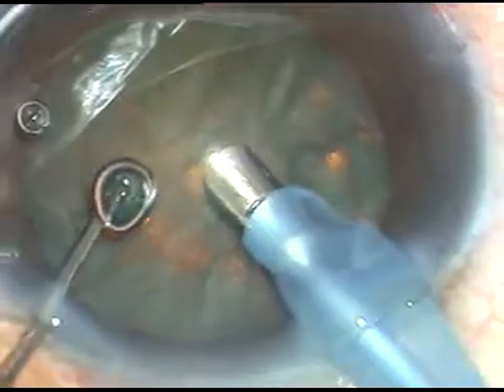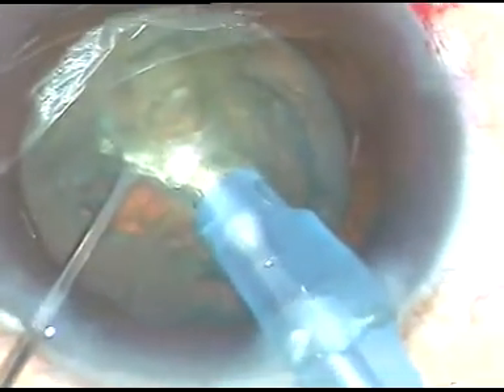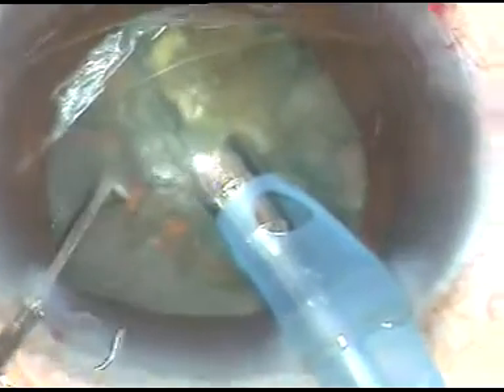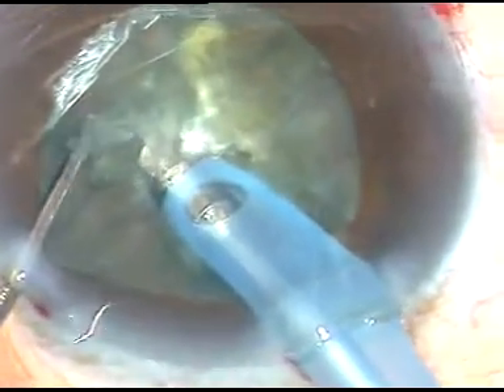Now, how to do it? Just watch these steps. Superficial lens matter view. This is a direct jab towards 5 o'clock. The tip is embedded deep into the substance of the nucleus — this is the first jab. I remain there for some time so that the fluid goes behind and over the posterior capsule towards the equator. Now this is a 3 o'clock jab.